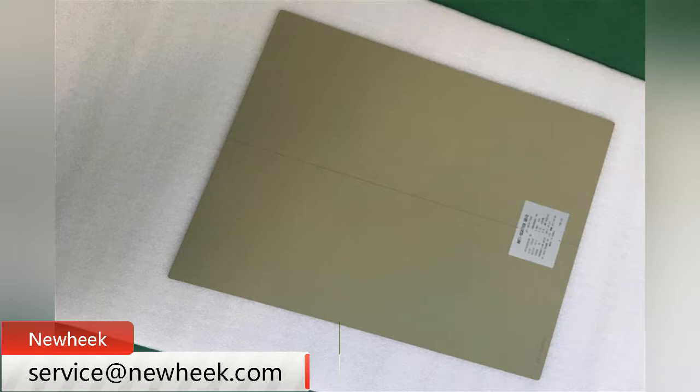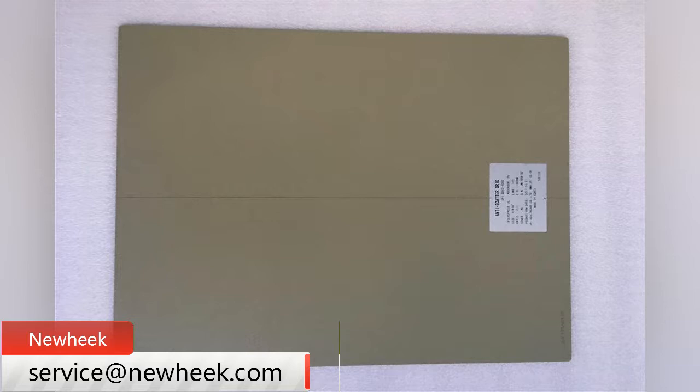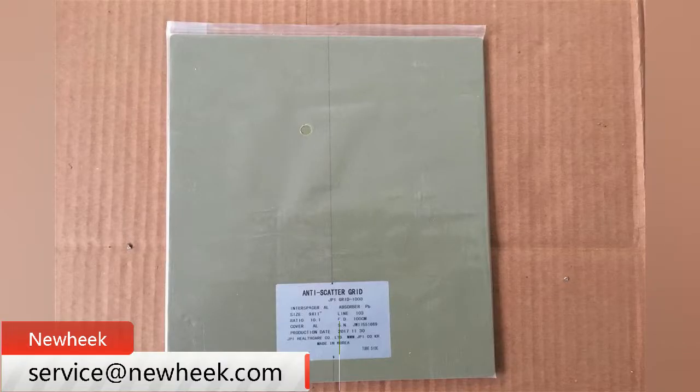High quality images are achieved by using aluminum spacer pads and lead strips, which are accurately milled to uniformity.